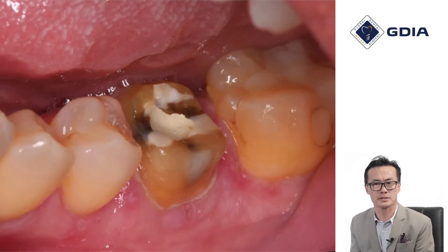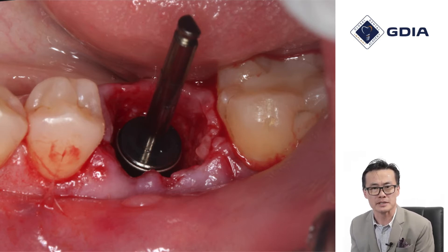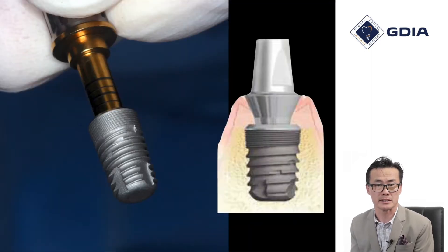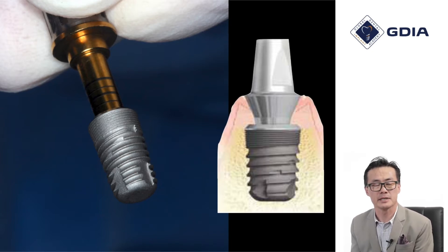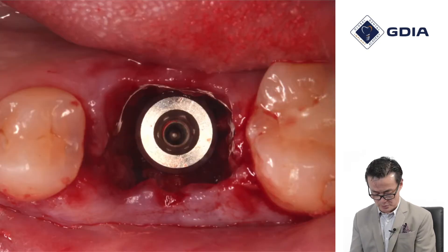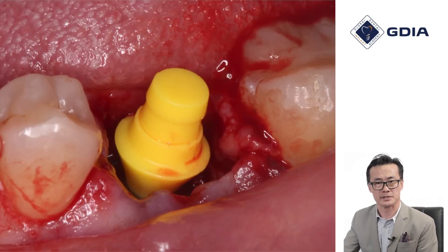Let's walk through this case quickly. This is a non-restorable lower left single molar that is being replaced. The tooth was carefully removed with minimal flap manipulation. Drilling is done to ensure an implant position in the immediate site. A fairly wide diameter implant — this is a SAVE model from Dentium, 5.5mm implant diameter — is being placed carefully into the prepared site. The driver is being used to secure the implant with very good initial stability in an ideal position.